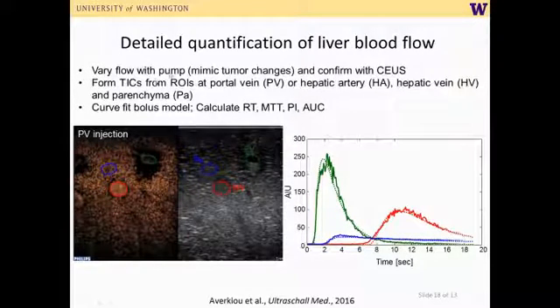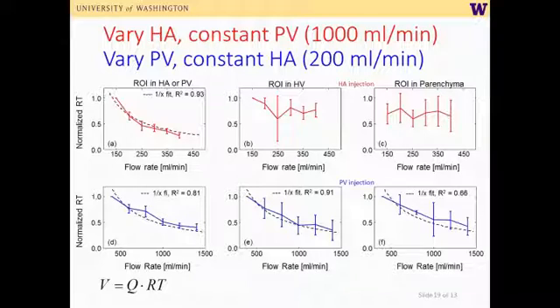So by varying the pump, we can then see if our quantifiable contrast-enhanced ultrasound is able to detect those flow changes. These are the results, and without getting into too much detail, I show you here time intensity curves when doing, in red, a hepatic artery injection, and when doing, in blue, a portal vein injection.